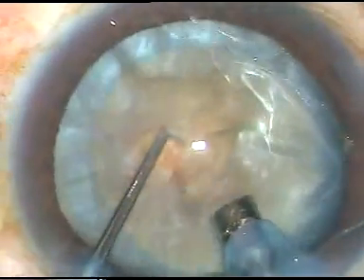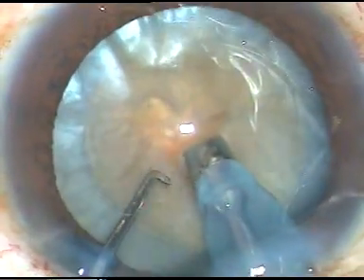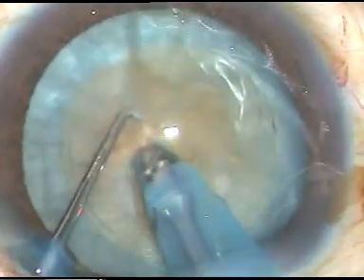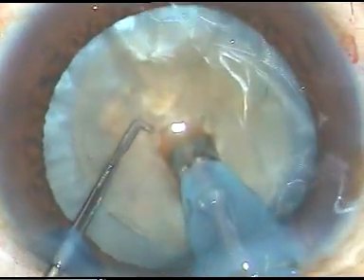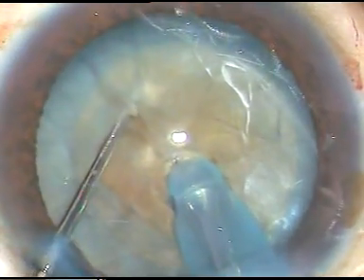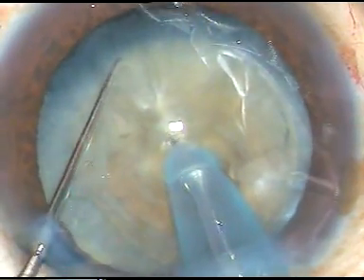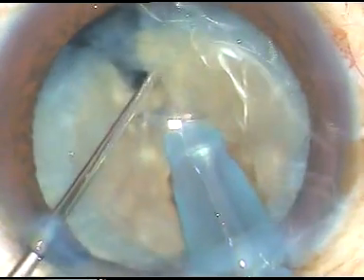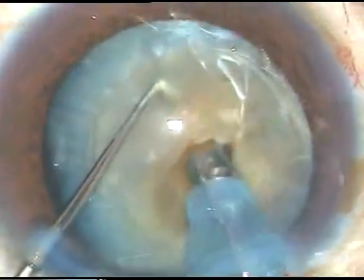This is quite a hard cataract. After a few sculpts, the tip is buried deep into the nucleus. It is advanced applying ultrasonic energy and the nucleus is chopped. This can be called a modified woodcutter's technique.